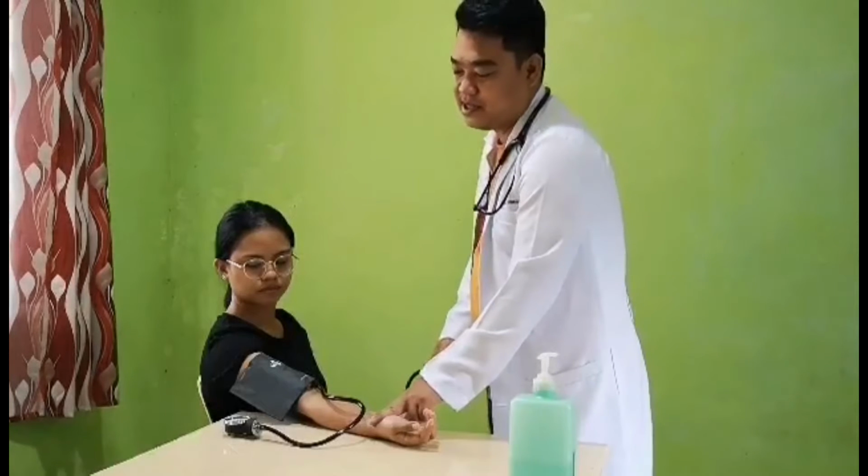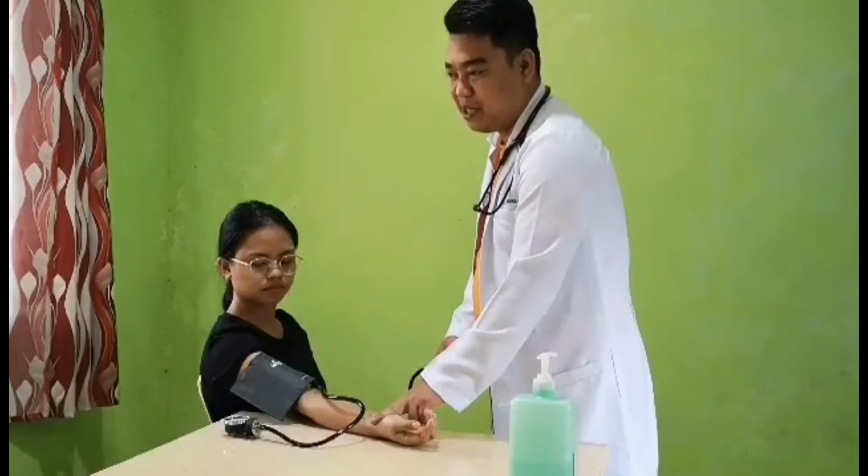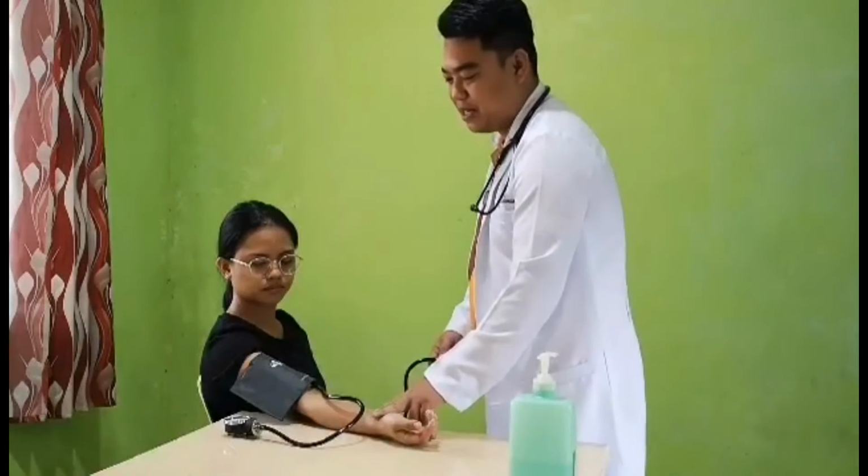In this case, the approximate systolic BP of my patient is 90 millimeters of mercury. So I'm going to take note of that reading.